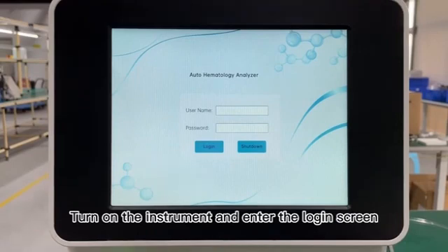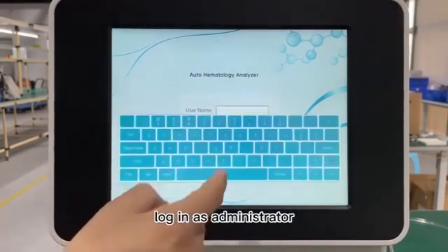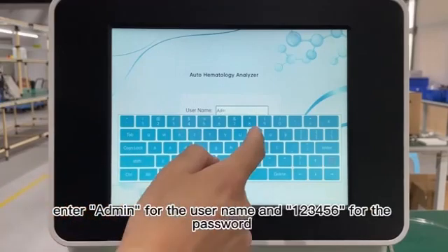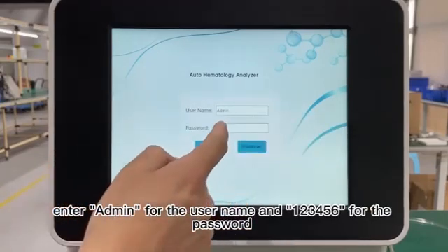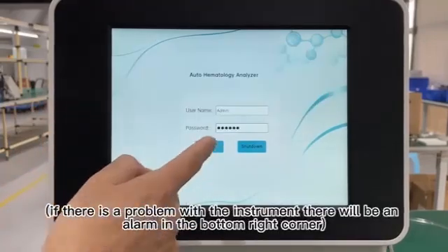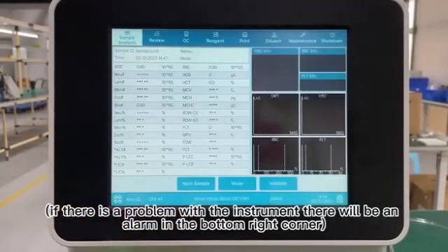17. Turn on the instrument and enter the login screen, login as administrator. Enter 'admin' for the username and '123456' for the password to enter the main analyzer interface. If there is a problem with the instrument, there will be an alarm in the bottom right corner.